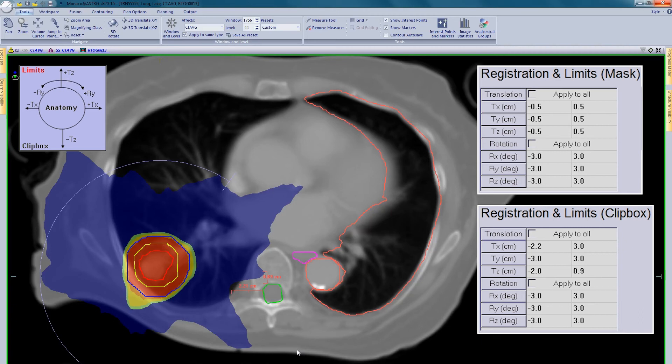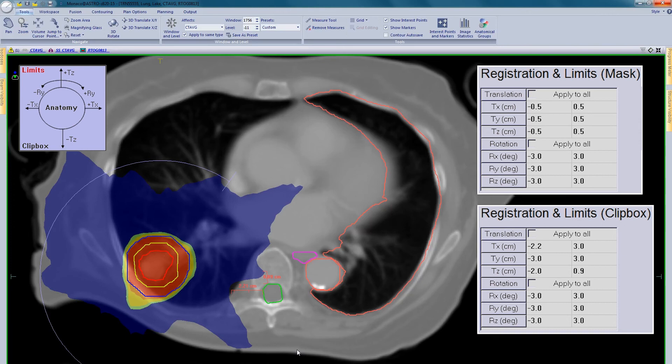At the time of treatment, the XVI software will prioritise the soft tissue match as default, and a slider bar can be used to try to find a compromise. If you have any questions regarding XVI or critical structure avoidance, please contact your local Elekta sales representative.